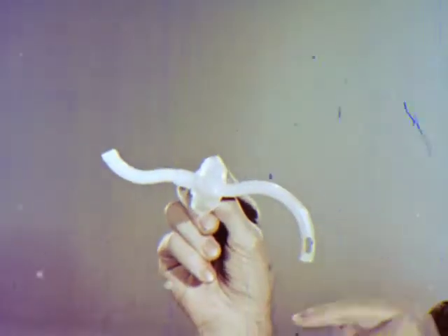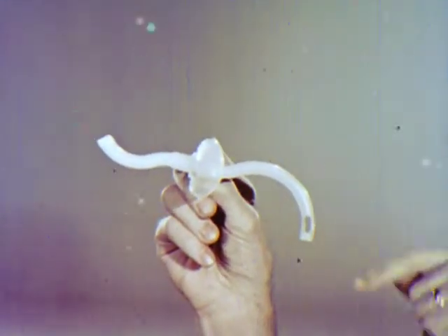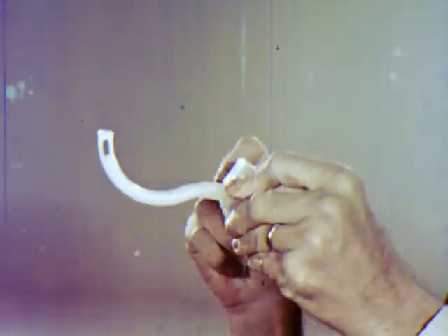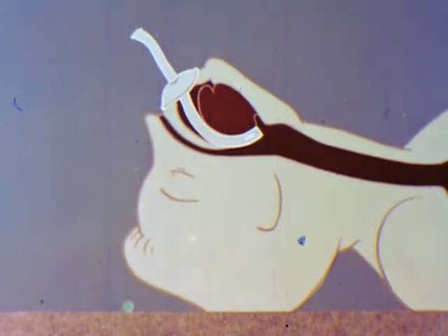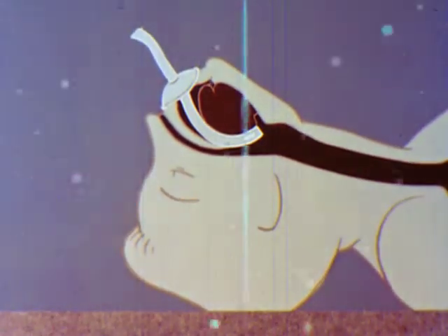For adults, insert the long end into the victim's mouth. For children over two years of age, invert the flange and insert the short end. This is the pediatric size for children under two. The resuscit tube makes mouth-to-mouth breathing more effective and easier to perform. It prevents obstruction by the lips and teeth and holds the tongue forward. Now watch how the resuscit tube is used to revive an unconscious, non-breathing victim.